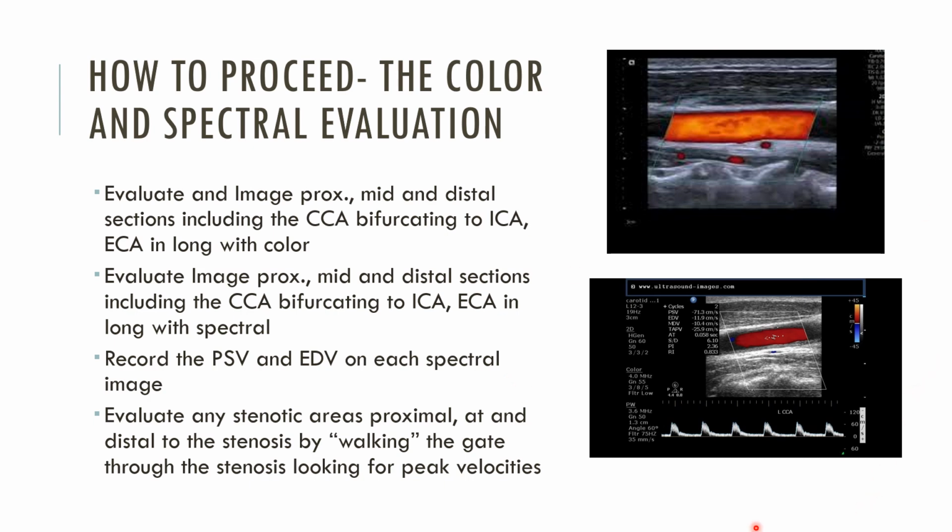Now, if you happen to encounter any sort of stenosis along the way, you would want to walk your gate carefully through that stenosis, and you would want to record the highest velocity you can find in that stenosis. And sometimes that's easiest to do by listening to the highest whoosh you hear come through. So here we see they're walking through, they're getting their spectral.